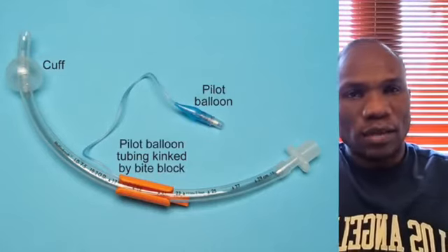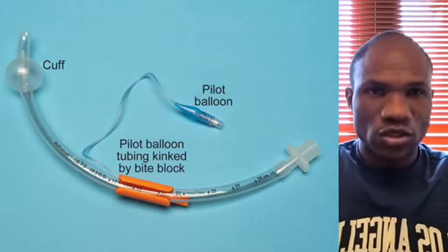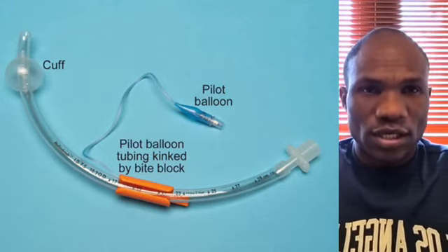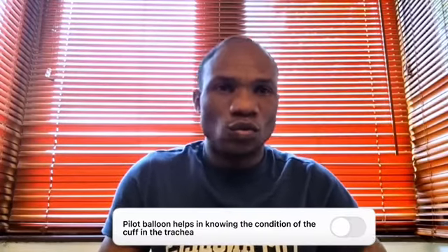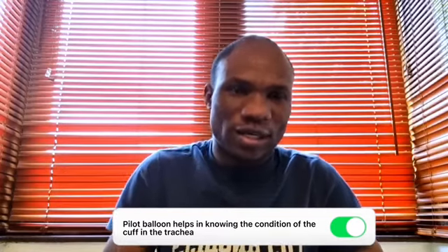Now, let me say something briefly about the pilot balloon. The pilot balloon is a part of the artificial airway that I mentioned the other time. That is the endotracheal tube or the tracheostomy tube. When you pass the tracheostomy or endotracheal tube into the patient, the cuff goes into the trachea, but outside you have the pilot balloon. So the pilot balloon tells you the condition of the cuff within the trachea.